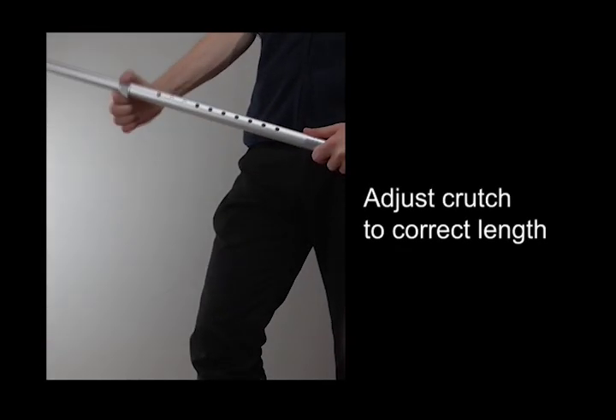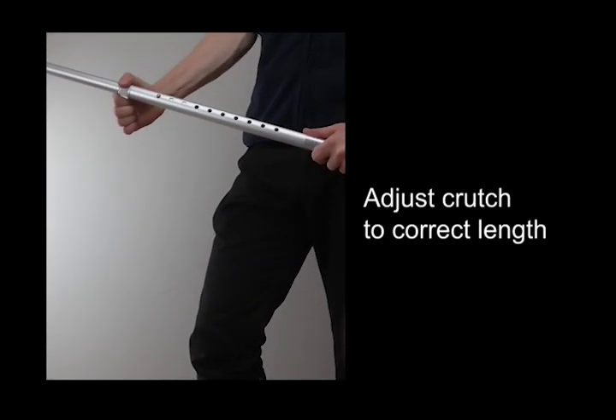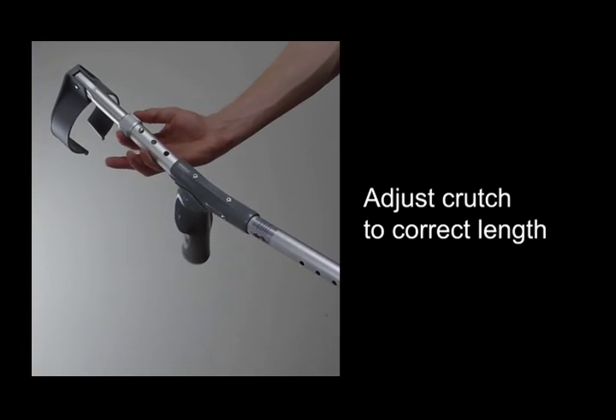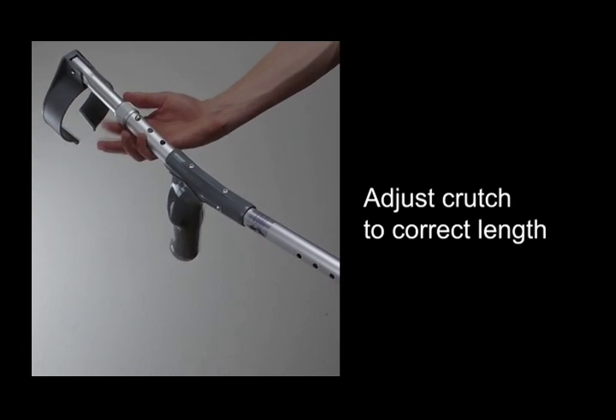You can adjust the height of your crutches by lengthening or shortening them, making sure that they click into place. Some crutches have a lock feature that fixes them in place. Similarly, you can adjust the height of the armband on forearm crutches to a comfortable position.